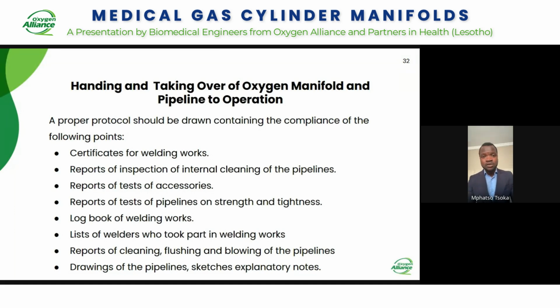also by the experts who know what they're doing on the field, because the whole system is going to be used on a patient, and you do not want to be the contributing factor towards deterioration of his health, but you want to be the factor that improves his life by giving the right services. So all these precautions and proper protocols must be followed, and the reports must also be handed over to the team.